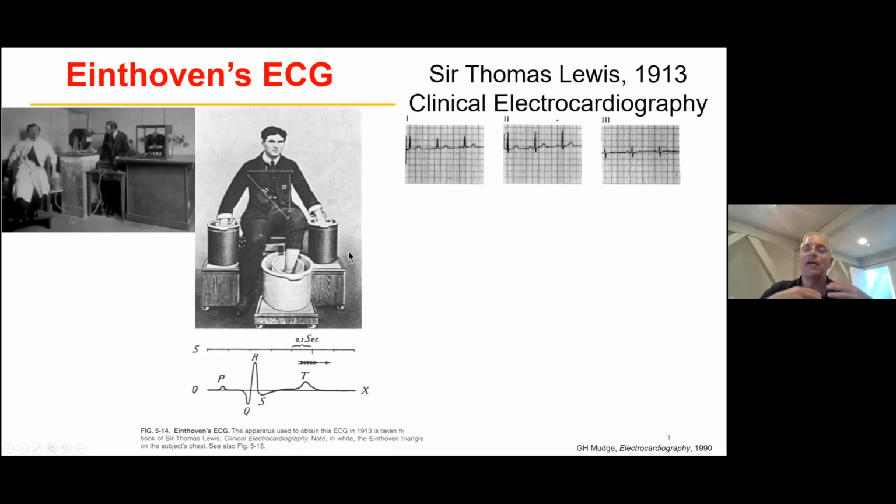Now, the way people learned about electrocardiograms was the way in which they were represented. This is figure 4 from Einthoven's original paper. In figure 1, he started with A, B, C. By the time he got to figure 4, it was O, P, Q, R, S, and T. And so it was an arbitrary labeling of an image of a 2-dimensional representation of a complex 3-dimensional event.